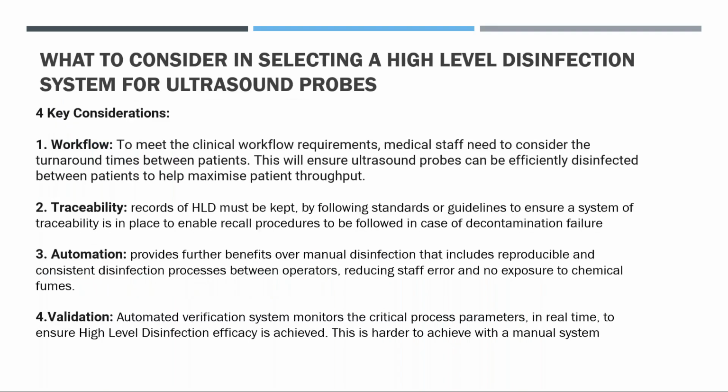When to consider and selecting a high-level disinfection system for ultrasound probes: 4 key considerations. First, workflow. To meet clinical workflow requirements, medical staff need to consider the turnaround time between patients. Obviously, the shorter turnaround time that provides appropriate disinfection maximizes patient throughput.